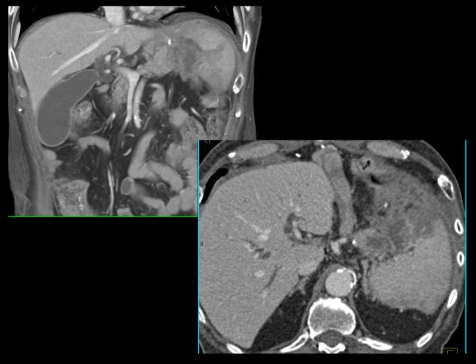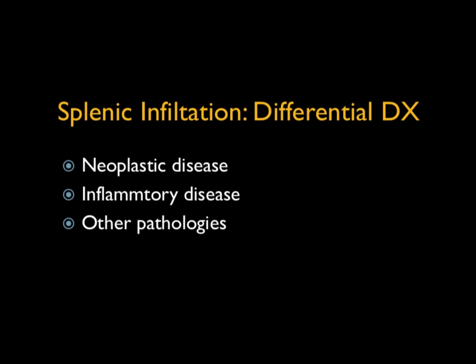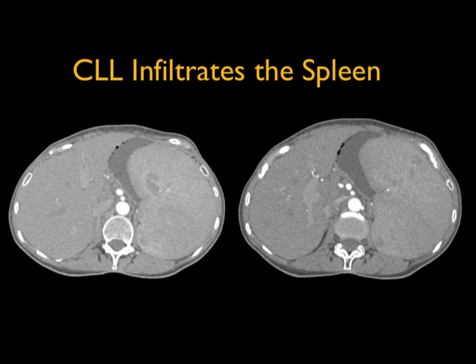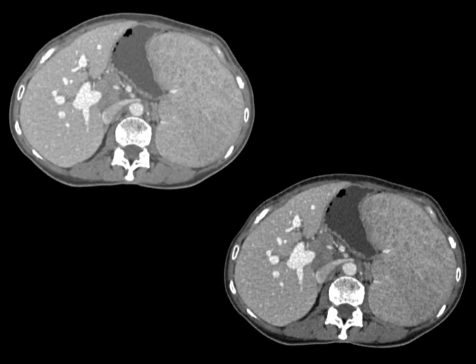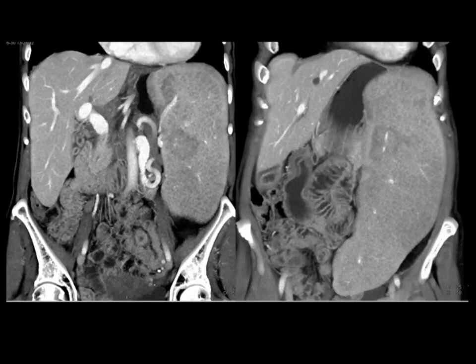We can see the infiltration around the splenic hilum and the infiltration into the spleen proper by direct tumor extension. When we talk about infiltration, we could talk about neoplastic disease like CLL or lymphoma, inflammatory diseases, and other pathologies. Great example of CLL: a very large spleen pushing on the stomach, with a salt and pepper appearance to the spleen. You can see it on the venous rather than arterial phase. That salt and pepper appearance is particularly impressive on these images — a very large spleen, beautiful diagnosis of CLL.